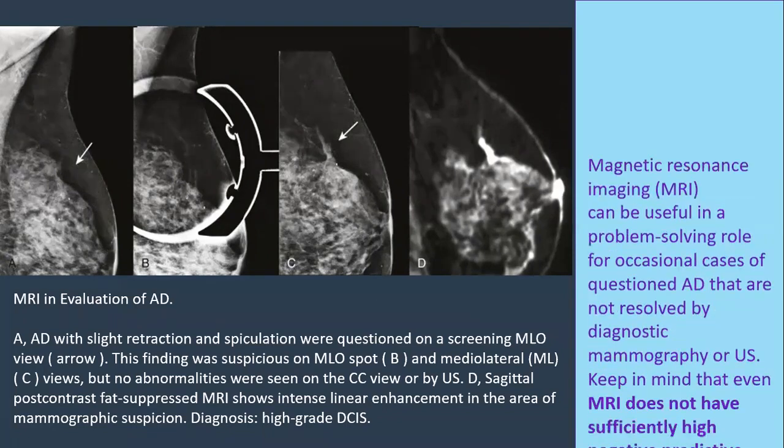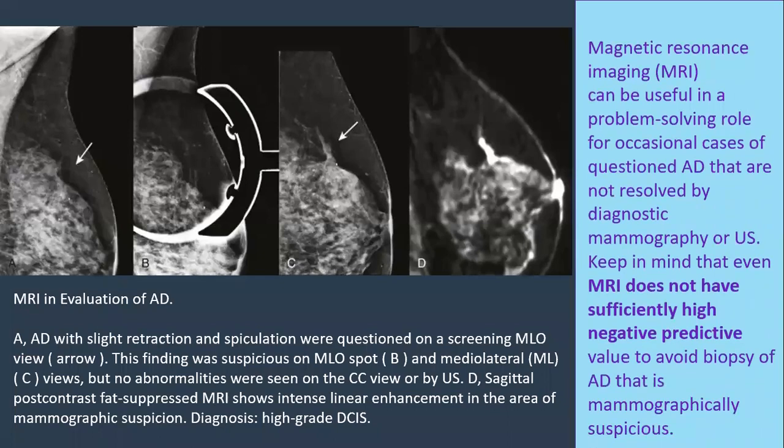Okay, but usually MRI is reserved only for challenging, problematic cases not resolved by diagnostic mammography or ultrasound. And we have to keep in mind that MRI does not have a sufficiently high negative predictive value. If it is normal, it doesn't mean that we can ignore the finding.